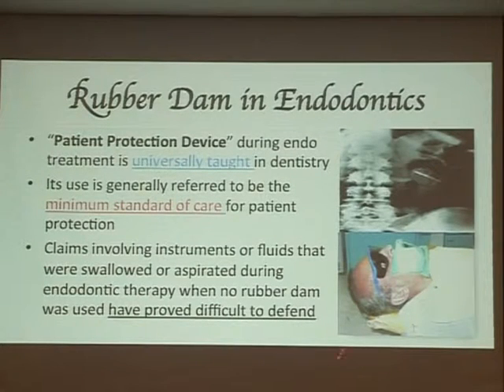And more than a rubber dam, we need glasses. We are using some caustic solution for irrigation. In a supine position, you may drop it into the patient's eye. There was a case report where the dentist got sodium hypochlorite in the eyes. The dentist himself. So you need to protect your patient, your nurse, and yourself from any potential injury.